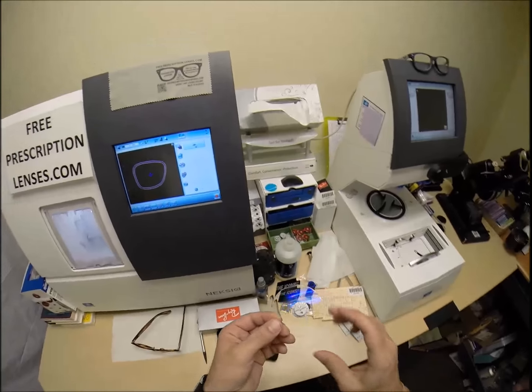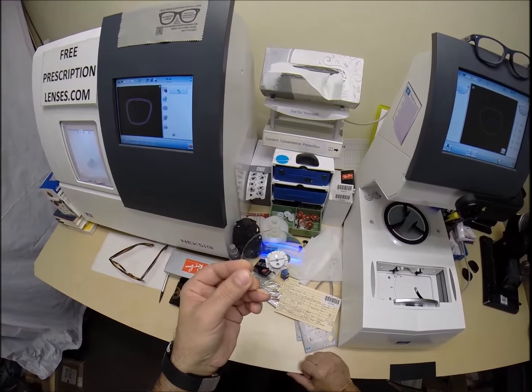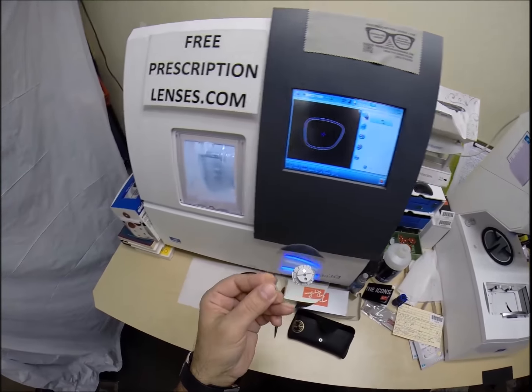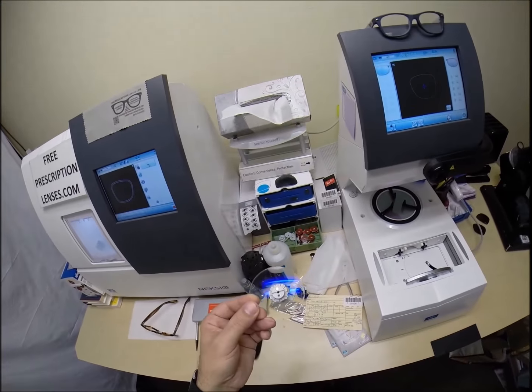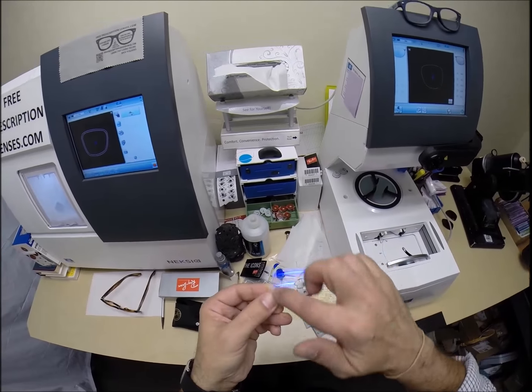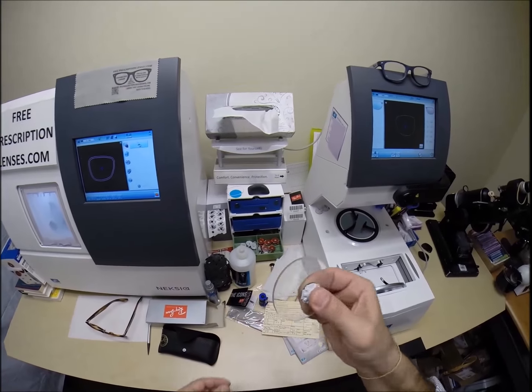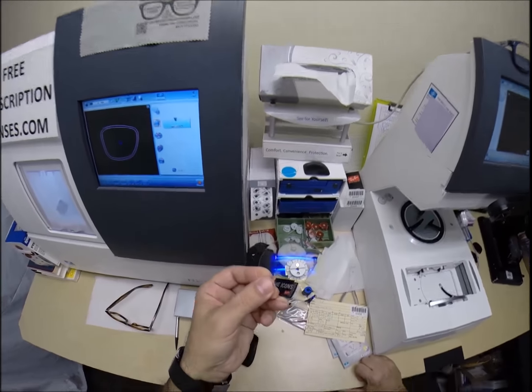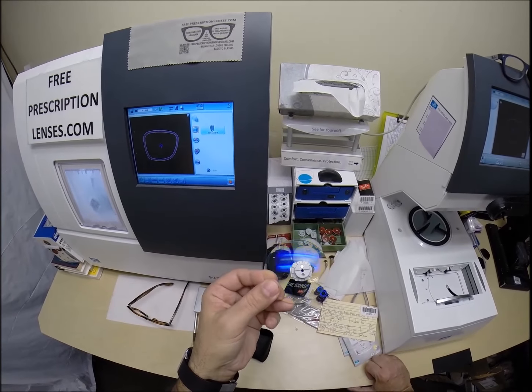Now, you upgraded to the Crizal Prevencia. This is the blue blocking lens from Crizal to block today's harmful blue light emitted from today's electronic devices, from cell phones, tablets, computer screens, anything else really, TVs. So this is the best blue blocking coating. It has a purplish hue to it. Now, this is also a coating that's on the lens. They spray on there before it is cut. It gives the lens a little bit more adhesive ability while it's stuck on the block. It's very hydrophobic, meaning that water will bead off of this lens. So I will clean off the protective surface and we'll see the final color of this lens.